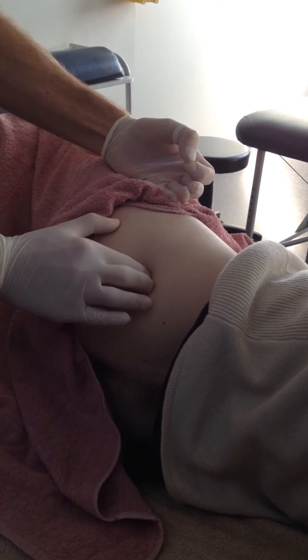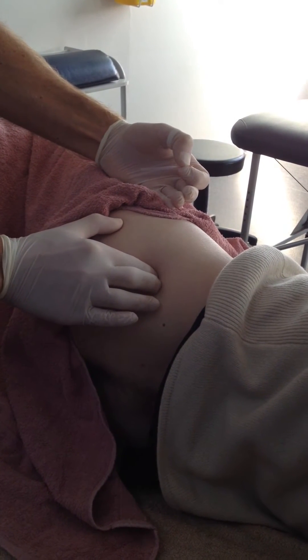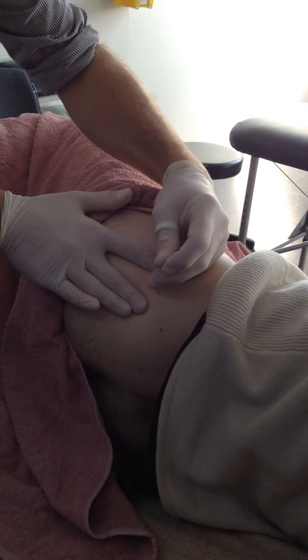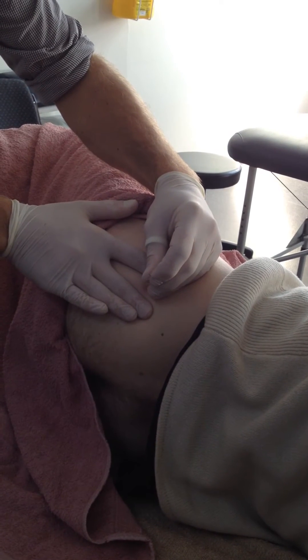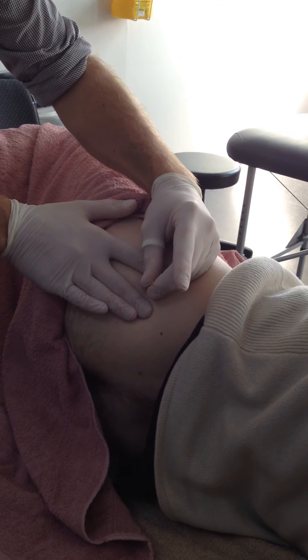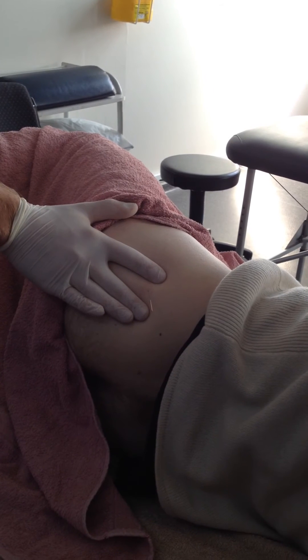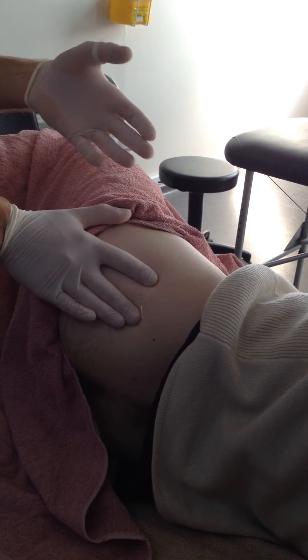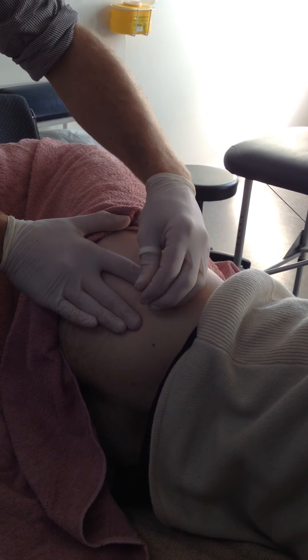So we'll needle directly into these trigger points here, which is that band there. Just hold this spot here for a bit of accuracy. We'll just put a bit more pressure on — not as critical as gluteus minimus to put really solid pressure on with the guide tube — and we'll tap that in. We could use a 75mm needle here if we want; I'm just using a 40mm because where we're needling is quite superficial anyway. So we should be able to get a reasonable response here.